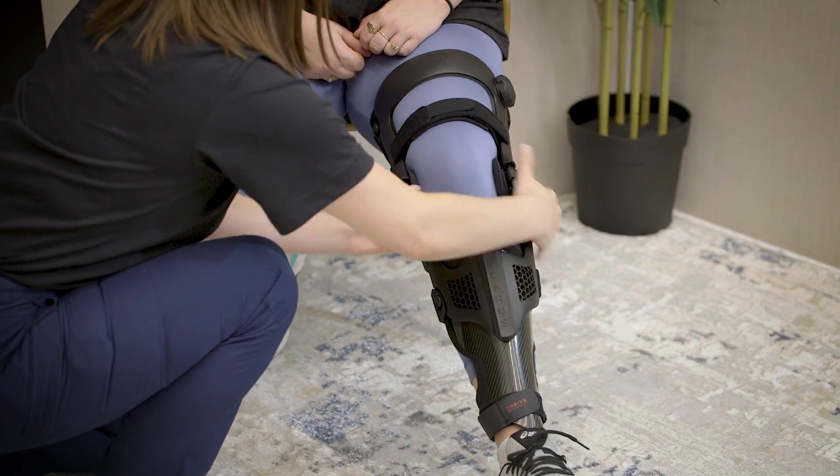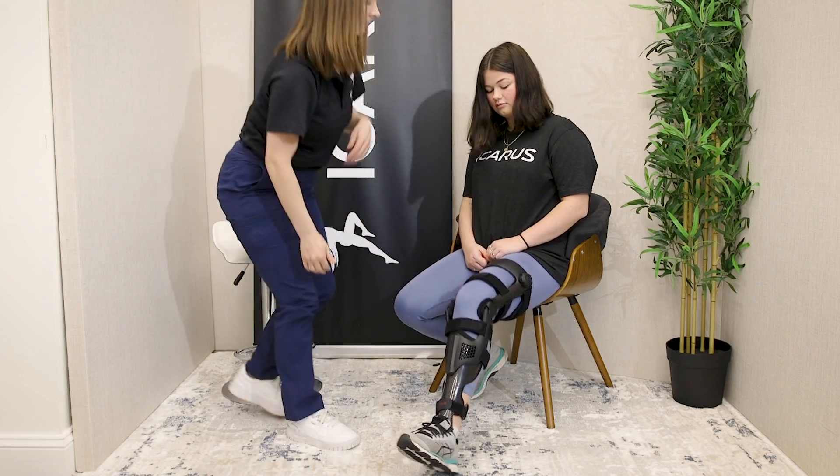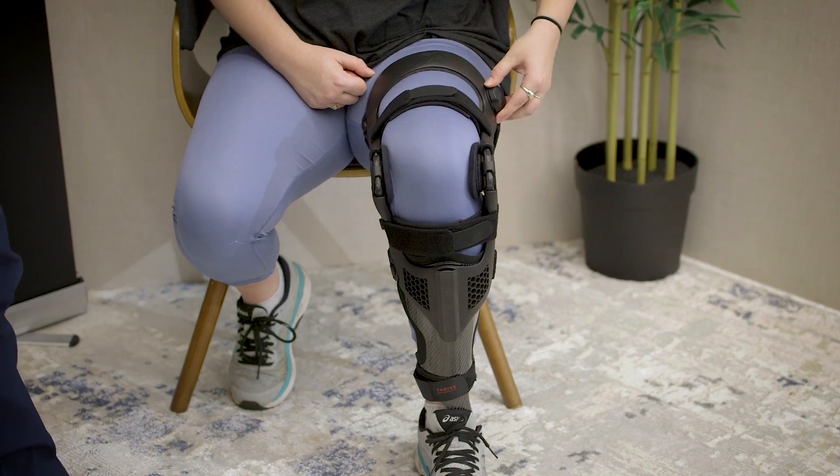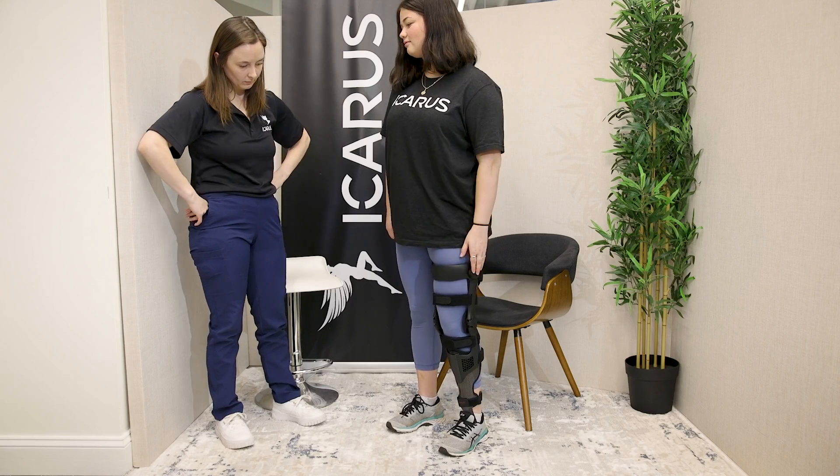Keep in mind the patient's comfort and function needs. Now that the brace has been fit, you will work with the patient to adjust their tension dial. Go over how to utilize this during their gait and other activities for their specific care plan.